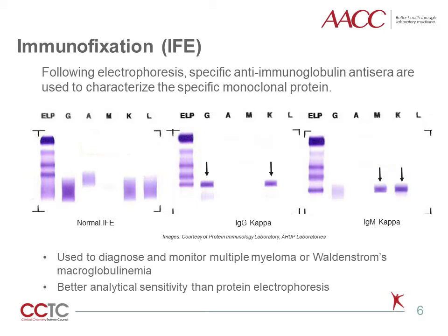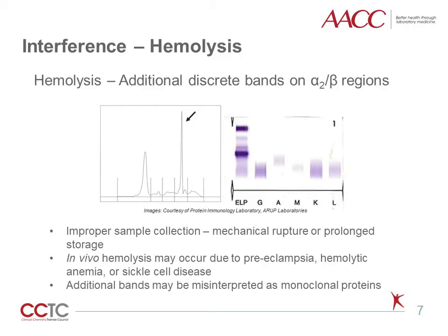IFE is also employed in cases where serum protein electrophoresis is unable to quantify small abnormalities, as it can happen with beta-migrating M-proteins or small free light chains. One of the most commonly encountered interferences in clinical laboratories is hemolysis, and electrophoresis can be affected by this interference.